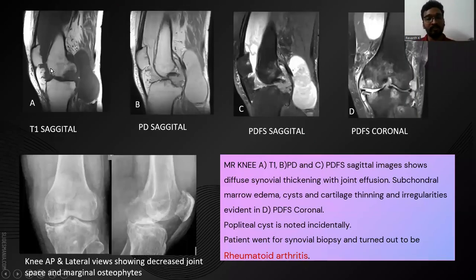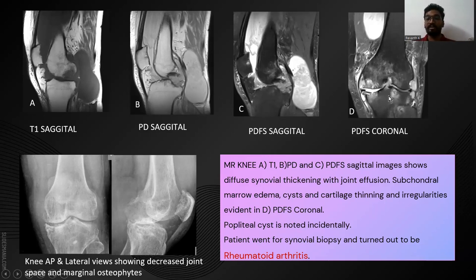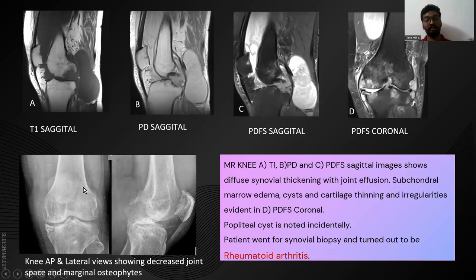In our case, on T1 sagittal, PD sagittal, and PDFS sagittal sequences, there is diffuse synovial thickening along the synovium, which is more evident on PDFS. On PDFS coronal you can see cartilage loss and sub-chondral marrow edema. This patient went for synovial biopsy and it turned out to be rheumatoid arthritis. The radiograph of the same patient showed bone erosive changes and marginal osteophytes.